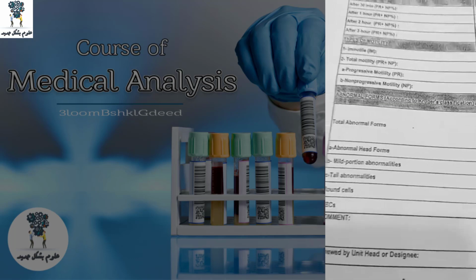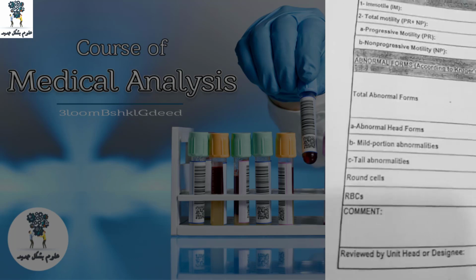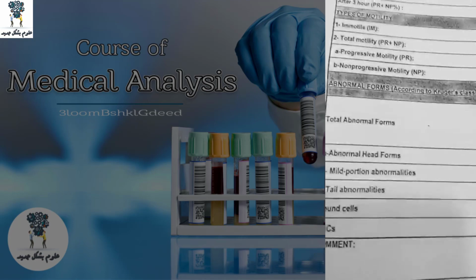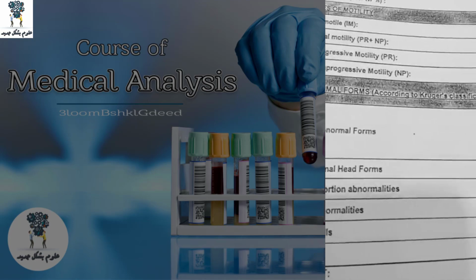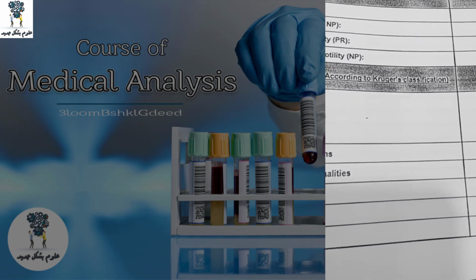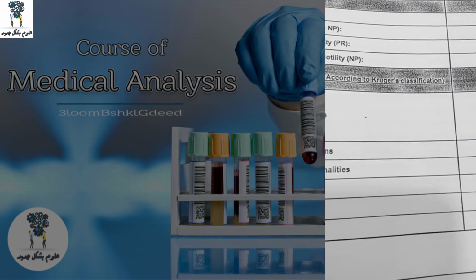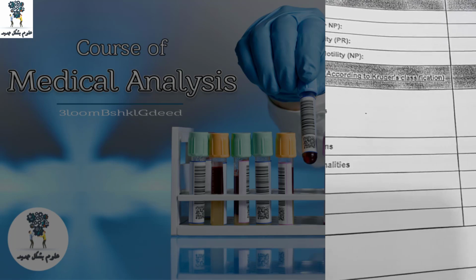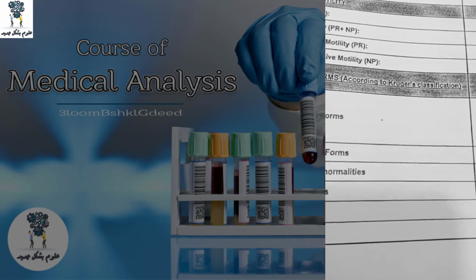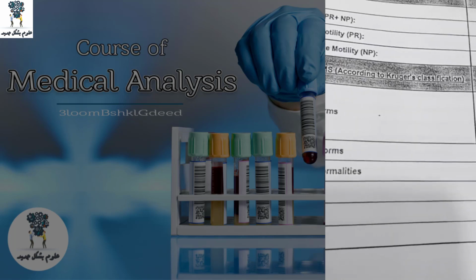في اللاب. طب بعد كده بنعمل ايه؟ انا خلاص وصفت وصف كويس. ببتدي في حاجة طبعا ولسه بوصفها، هي الراوند سيلز. احنا كنا لسه بنتكلم عن الراوند سيلز لان في ناس في ريبورتات عندهم طبعا بيبقوا عاملين السبرماتوجينيك سيلز، او كلمة سبرماتوجينيكس هي الخلايا الموجودة اللي بتطلع سبرمز، فاسمها سبرماتوجينيك سيلز. طيب بتبقى موجودة. طب في ناس بيبقى فعلا ما بيبقاش فيه spermatogenic cells، وده it's a problem. so انت بتكتبها. طب في spermatogenic cells او بنقول انها العدد بتاعها كبير جدا، فبنكتب ان العدد over قوي ومفيش في نفس الوقت سبرمات.